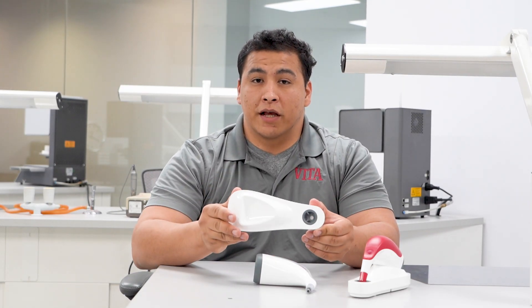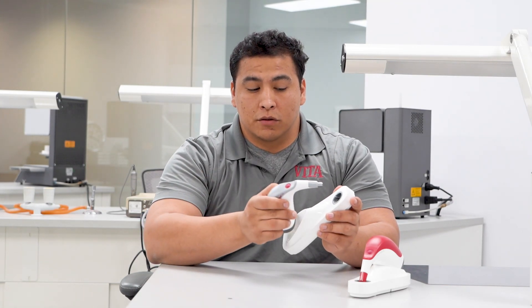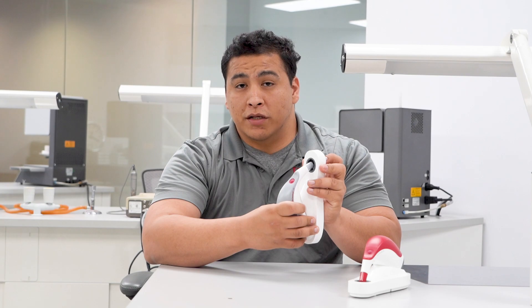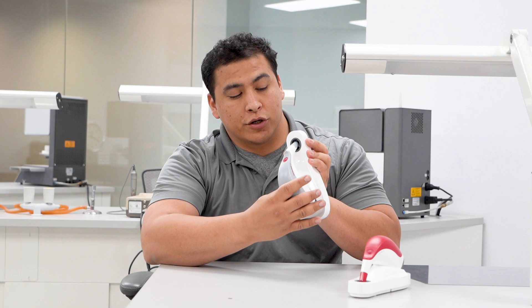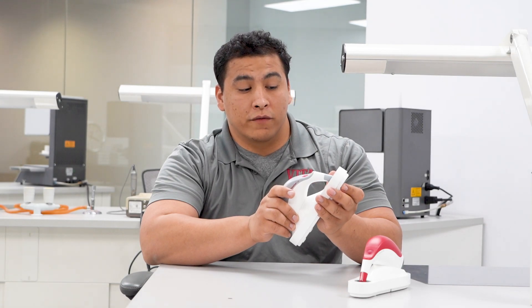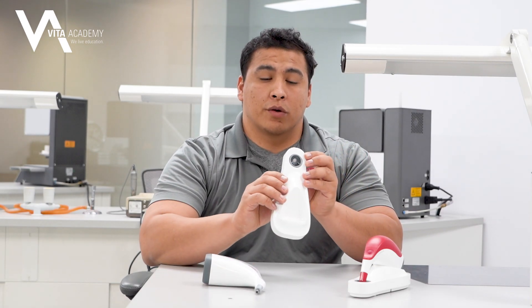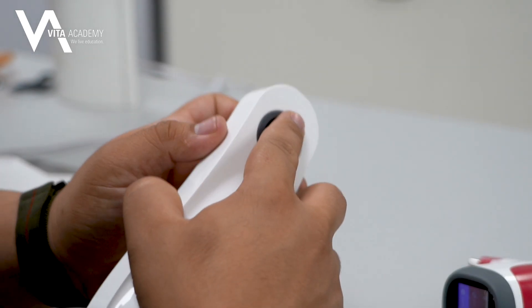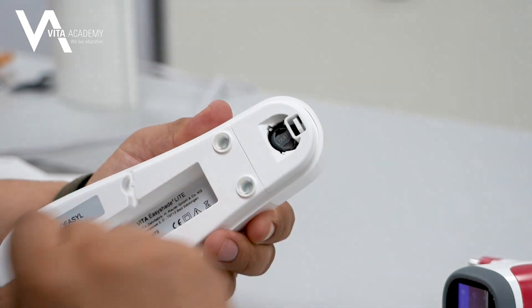Another thing to keep in mind — this applies to both the EasyShade 5 and the EasyShade Lite. When the unit is placed directly onto the base, it recognizes and calibrates itself by pressing firmly against the calibration block. If this calibration block is dirty for any reason — any kind of foreign matter — or if it becomes jammed down, you can have a miscalibration. If it becomes stuck in the down position, it's very simple to reset: just turn the unit over and firmly push on the back of it, and it'll return to its original top position.